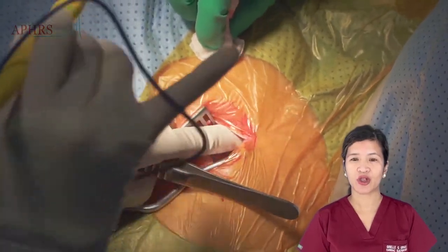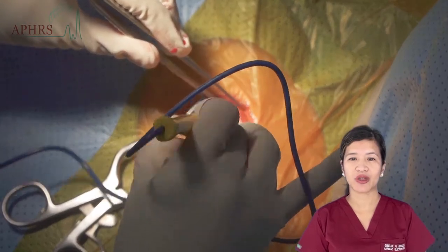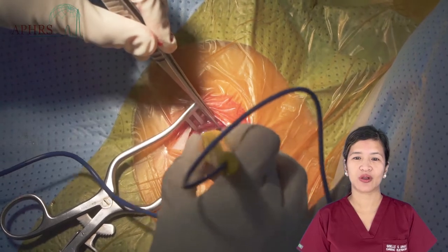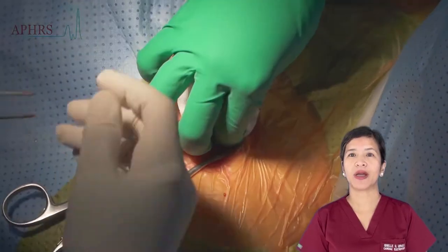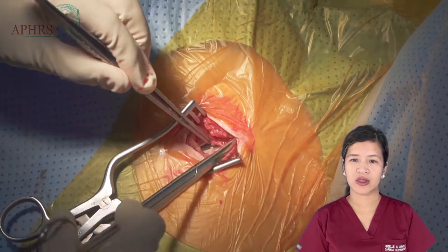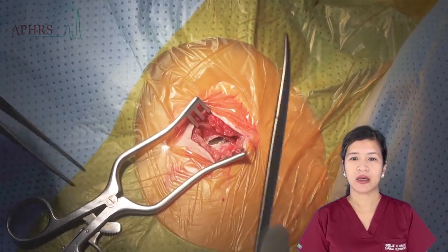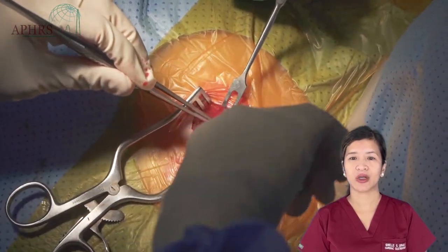Unfortunately in this case, there were portions of the lead that were positioned superficial to the generator, so we could only use electrocautery up to a certain extent, after which we had to shift to blunt dissection using the Metzenbaum. This allows us to isolate the lead safely and not cause undue damage to the lead itself or to the insulation.